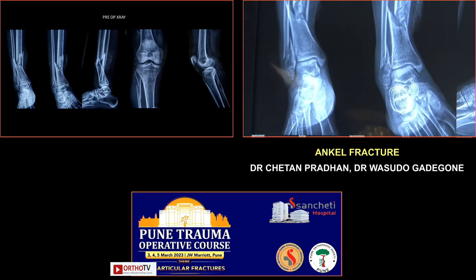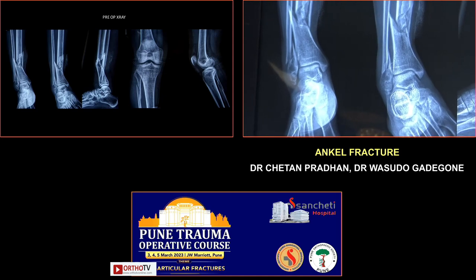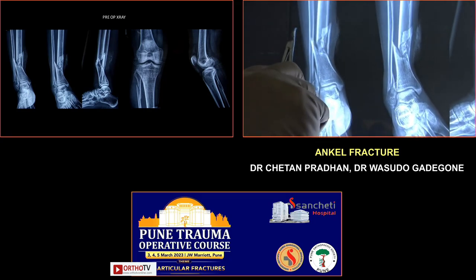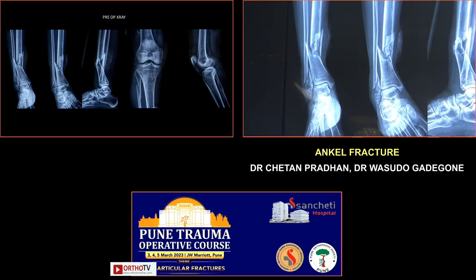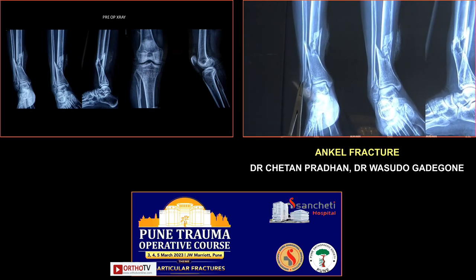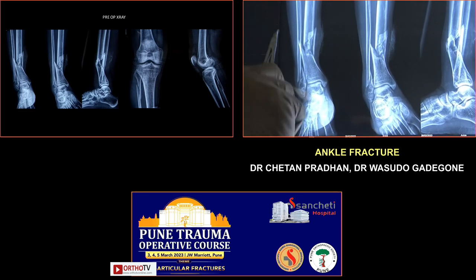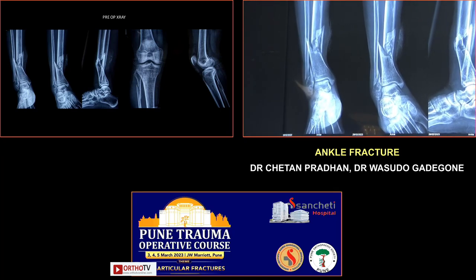Till the time you kickstart the case, can you tell us the indications wherein you will fix the fibula? Yes. My indications are usually 6 centimeters above the joint line. If you have a fracture line there, then we are looking at an unstable ankle because of the fibular fracture. So, I always would want to fix the fibula in that case. Also, where you have a tibial fracture concomitant along with a fibular fracture in that area, I always fix the fibula first and then nail the tibia.